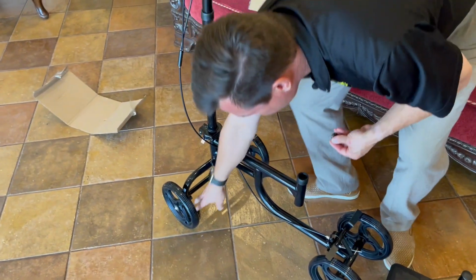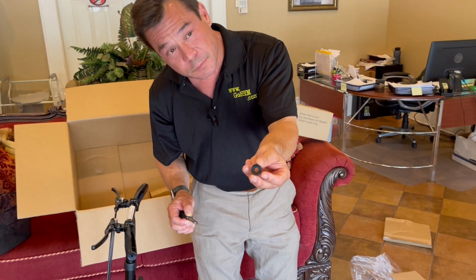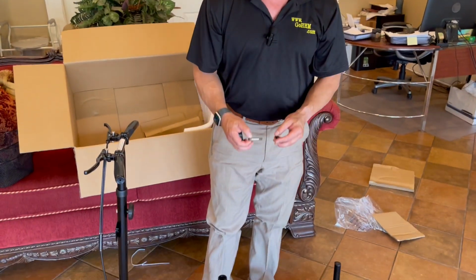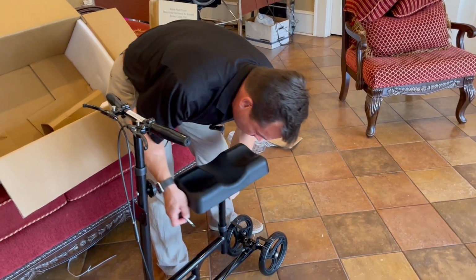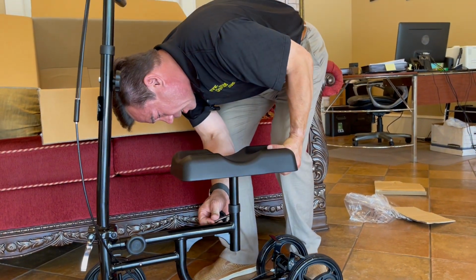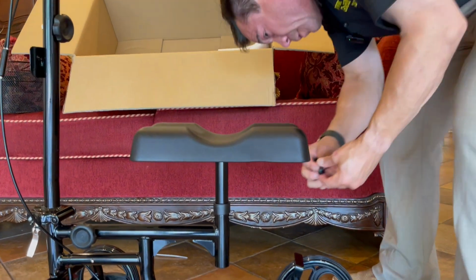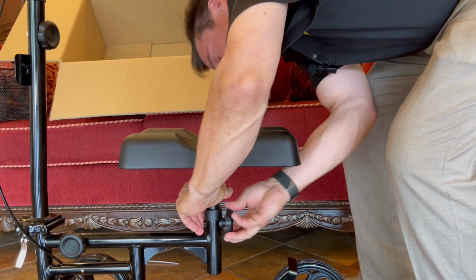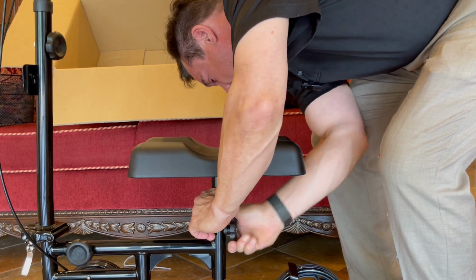And last but not least, in this particular case, this bolt is a little bit different. As you can see, you've got a little piece here, a little washer. Now what that does is that makes this fit nice and tight and hold this seat very tight, because we want your knee to be very steady upon this thing. So we're going to slide this down onto here like so. Find one of the height adjusting holes on the knee scooter and put our washer on like so that when this is screwed on, it goes nice and snug against the back of it. All right.